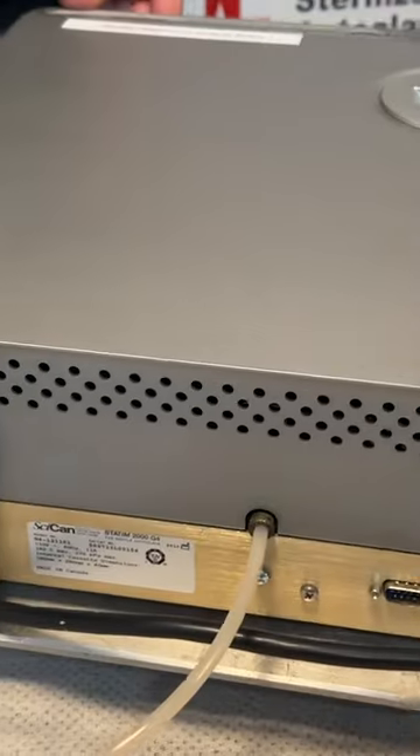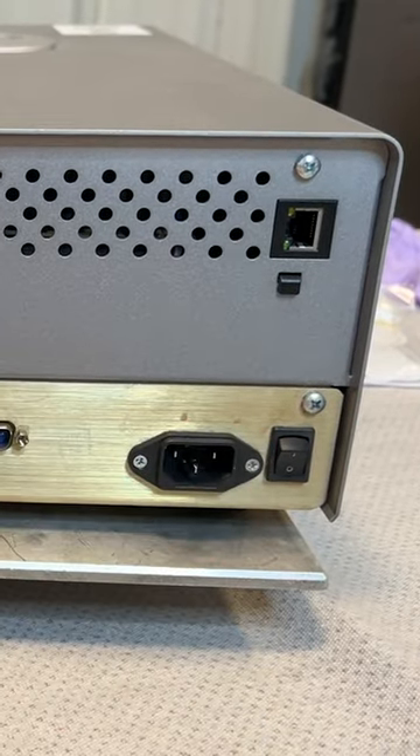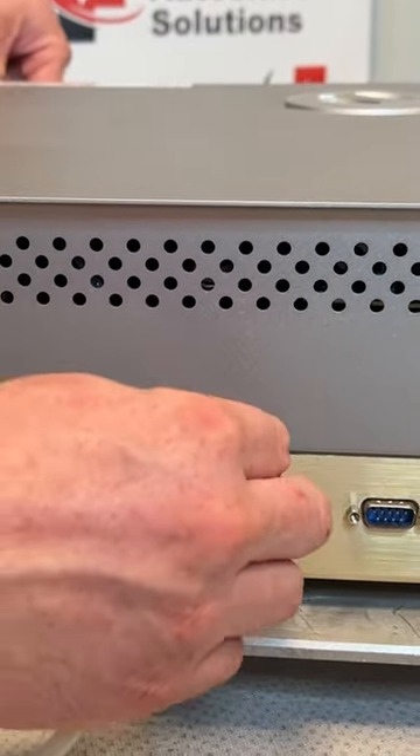Next thing we're going to do is come back to the back and turn it off with that rocker switch. I'm going to unplug the unit, put that off to the side, and remove the waste tube.